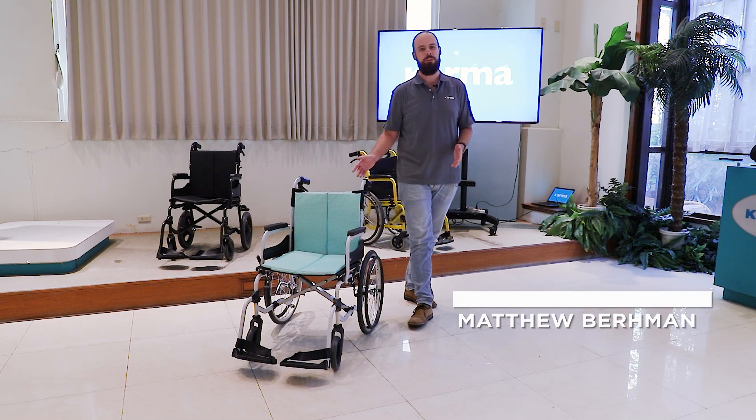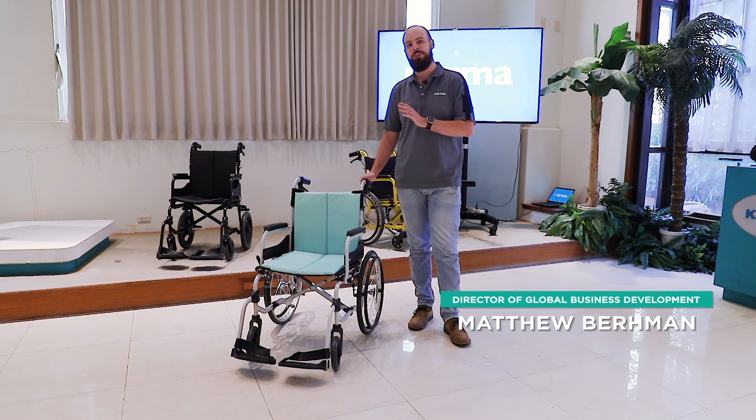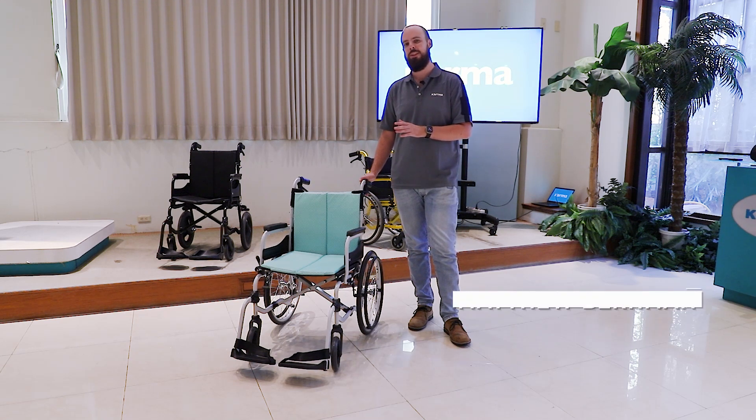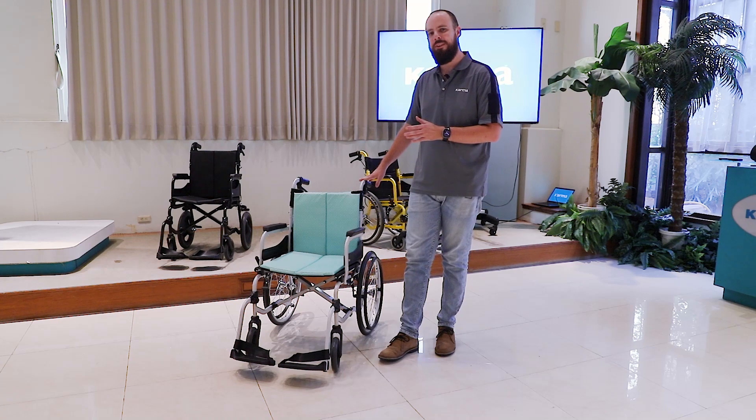Hi, my name is Matt and I'm the director of global business development here at Karma. Today I'd like to introduce the newest entry to our Soma line of lightweight affordable manual wheelchairs — this is the Soma 215.